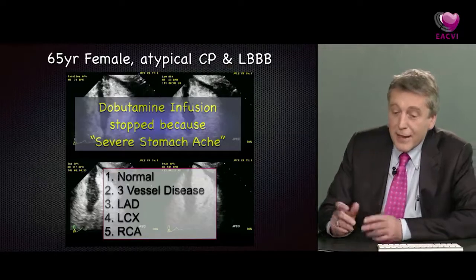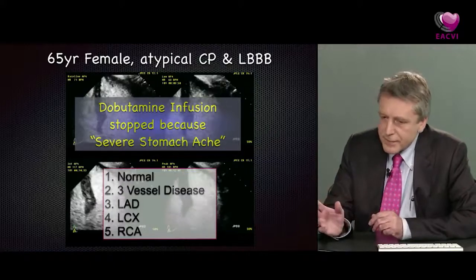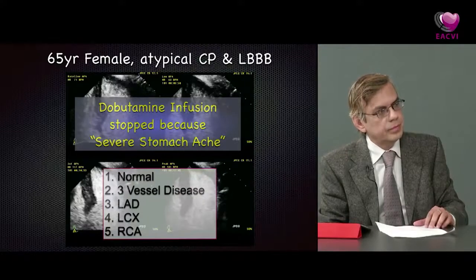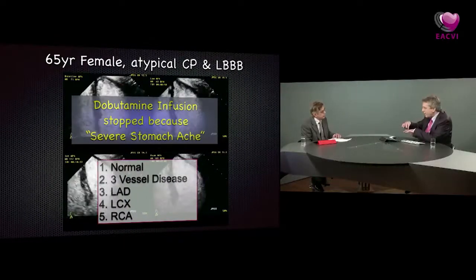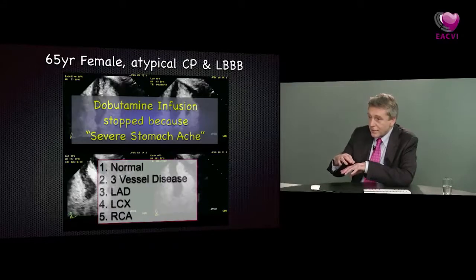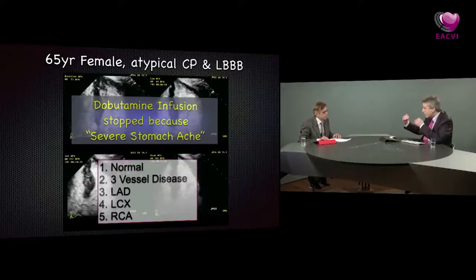Yeah, that is something that takes a bit of practice, but there are some basic rules to follow. First of all, when you're looking specifically at the apex, it's helpful to have the focus nearer to the apex. Don't have it right down at the basal portion of the ventricle, because the scan lines will be narrower at the apex and won't overlap each other. That increases the sensitivity and also reduces destruction, which can occur by overlapping scan lines. Secondly, make sure there isn't any attenuation, because attenuation can produce a pseudo defect in the more basal LV segments.